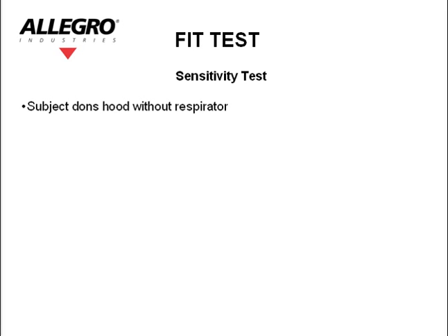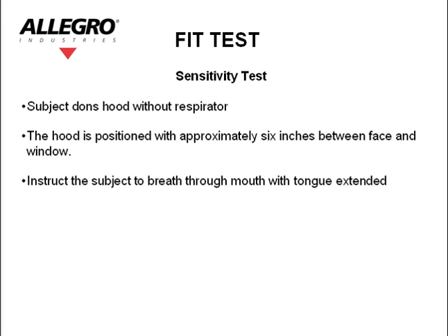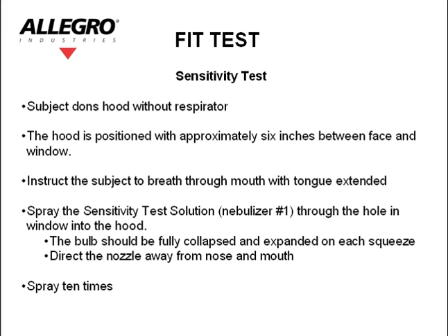Sensitivity test. The subject dons the hood without a respirator. The hood is positioned with approximately 6 inches between the face and the window. Instruct the subject to breathe through their mouth with their tongue extended. Spray the sensitivity test solution — nebulizer number 1 — through the hole in the window into the hood. The bulbs should be fully collapsed and expanded on each squeeze. Direct the nozzle away from the nose and mouth. Spray 10 times.